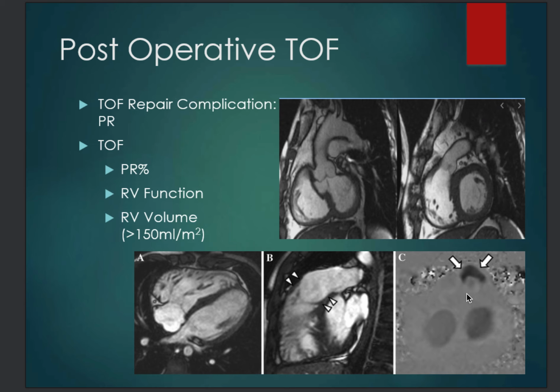Sometimes during the MRI flow, if the pulmonary regurgitation is severe or there is a free regurgitation, it's not accurate measurements. So if you measure 50 in one follow-up and 56 or 48 in the second follow-up, as a matter of fact, over the severe range, usually you will not be able to get accurate measurements.